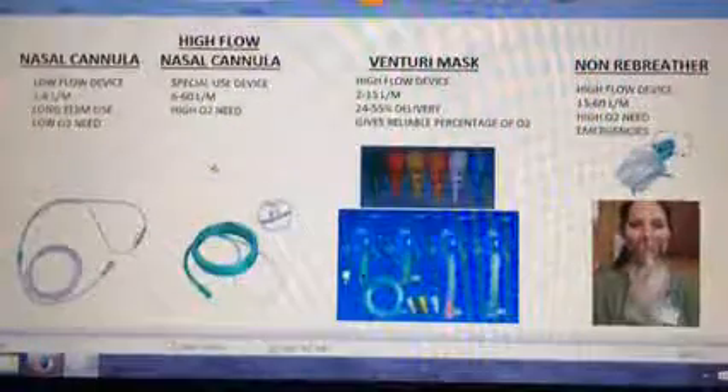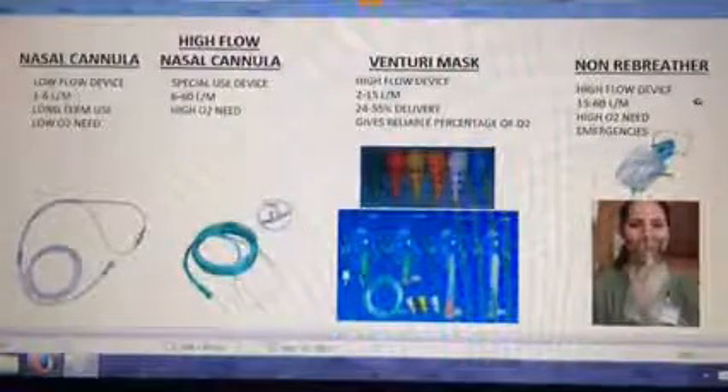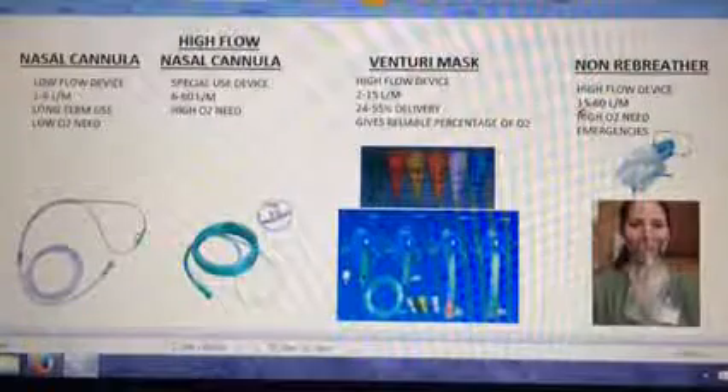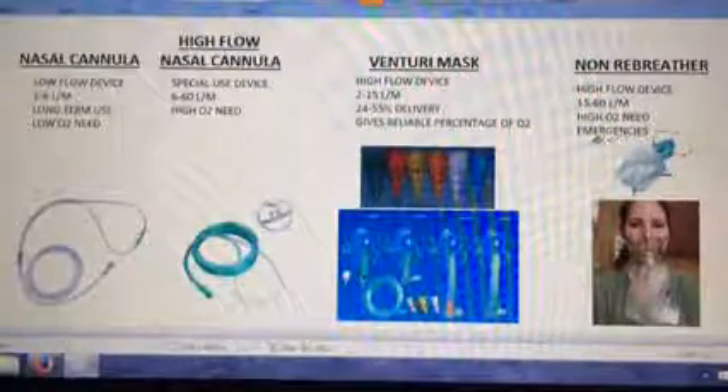First of all, in an emergency, use a non-rebreather. This is considered a high flow device — it gives the patient all the oxygen that they need. When you attach it to the oxygen, use 15 to 60 liters per minute. It is for high O2 demands and emergencies.